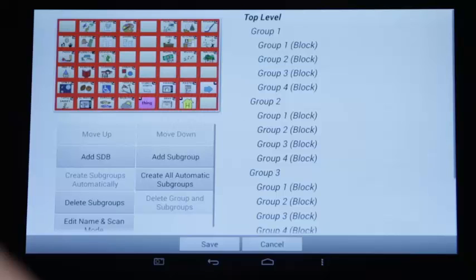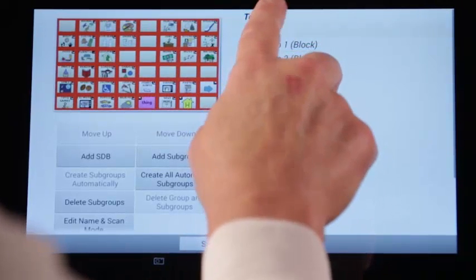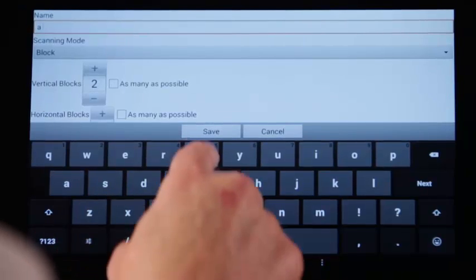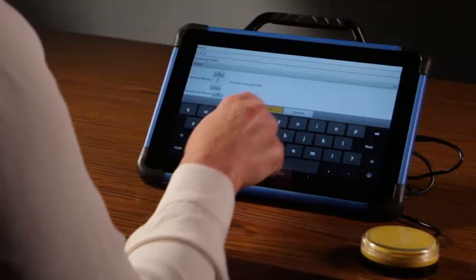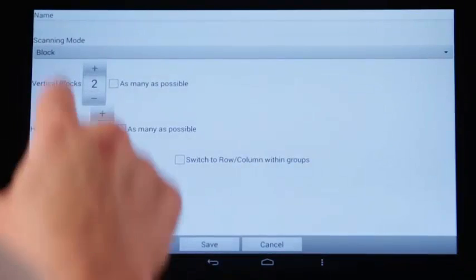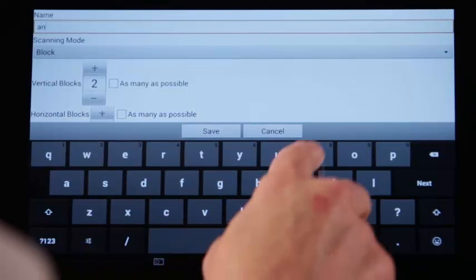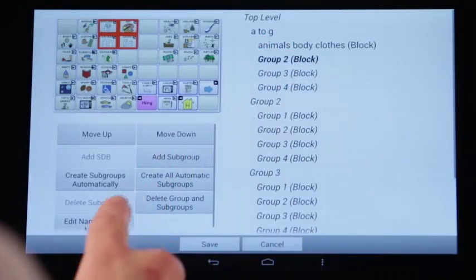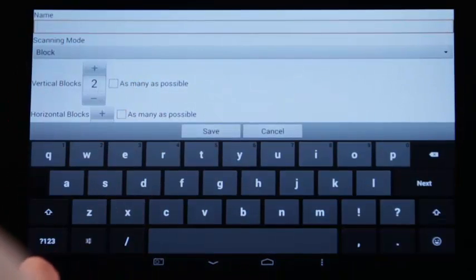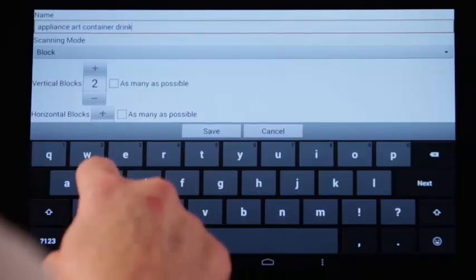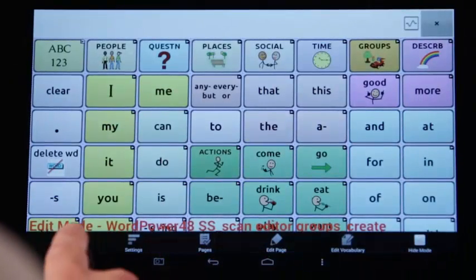When I edit the name and scan, I will not change the scan pattern, leaving it set to block. Tap Group 1, tap Edit Name and Scan Mode, type A to G. The blocks are set to the same pattern we created in Settings. Tap Save. Now we can set up the first subgroup. Tap Group 1 and type Animals, Body, Clothes. Tap Group 2 and type Appliance, Art, Containers, Drinks, and we will continue to edit the rest of the page. I have completed the information in all the groups. Let's take a look at the page completed.